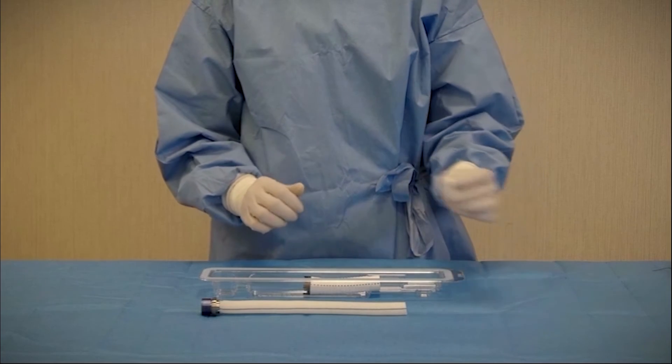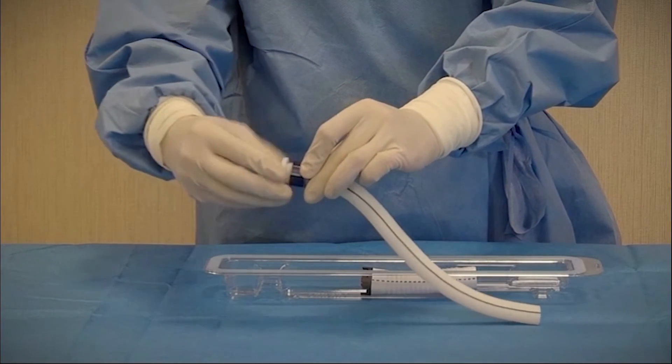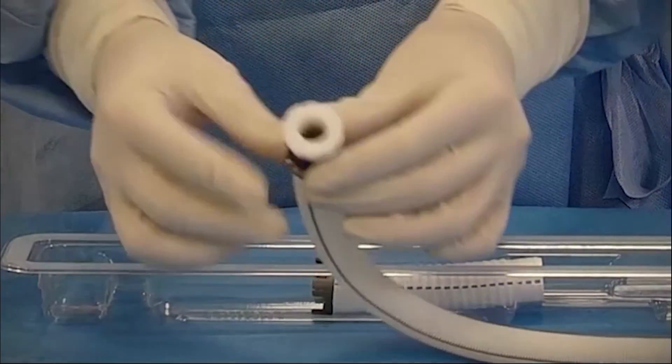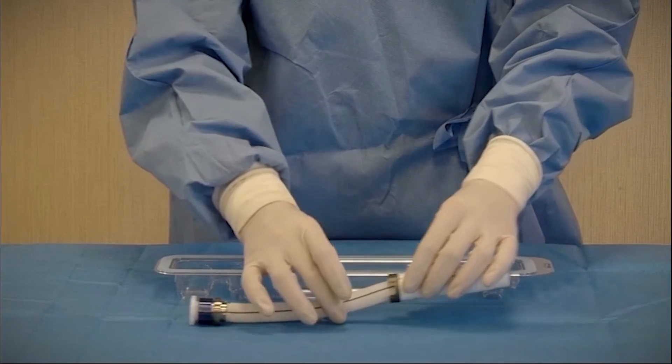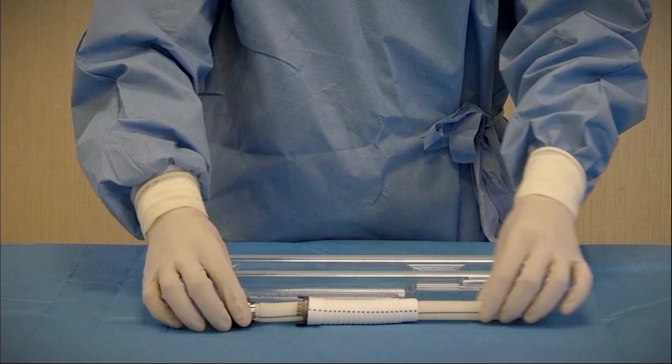Next, attach the open thread protector to the screw ring. The thread protector should be left attached to the screw ring connector in order to prevent blood from interfering with the threads. Slide the bend relief back onto the graft with the metal end toward the screw ring. It should remain disengaged for the de-airing procedure later.